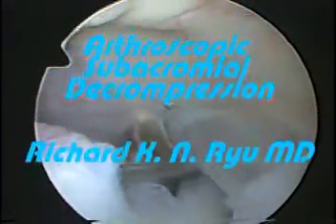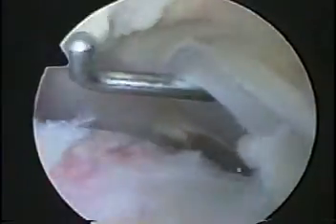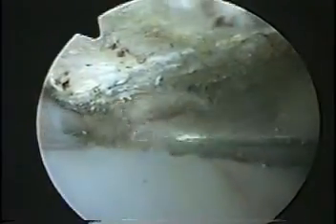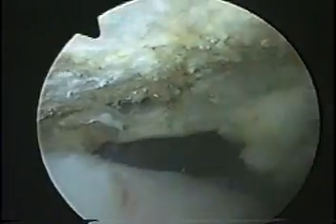Arthroscopic subacromial decompression is performed in individuals with external impingement syndrome. Step 1 is to verify pathology in the subacromial space with fraying of the CA ligament and matching changes on the bursal aspect of the rotator cuff. Once a diagnosis has been confirmed, debridement of the acromion is carried out with any commercially available ablation device.